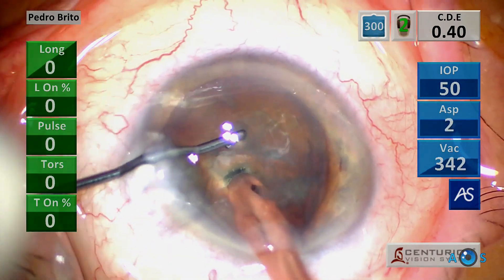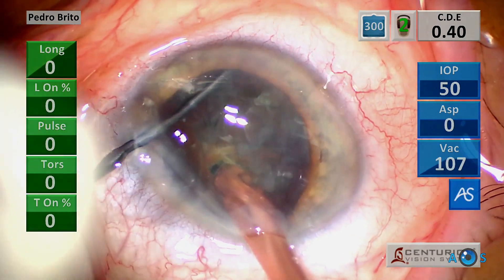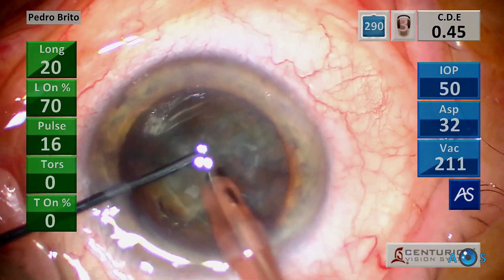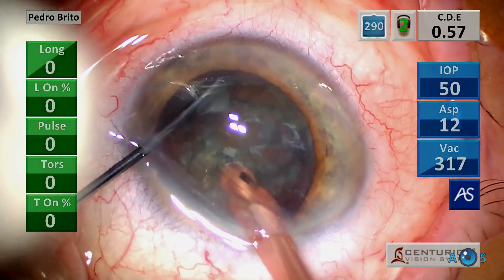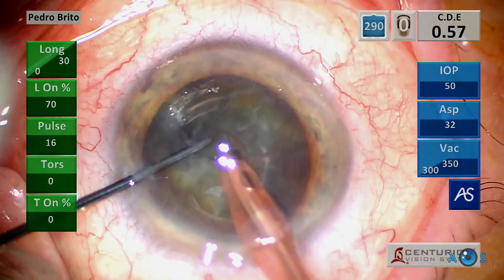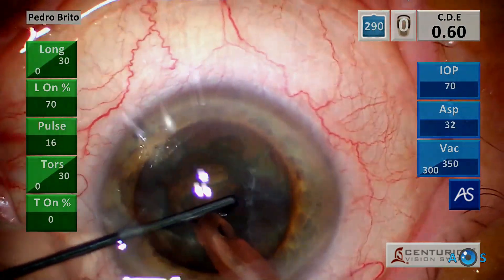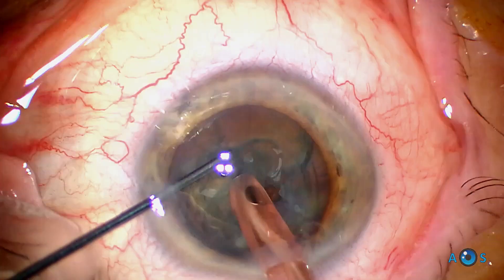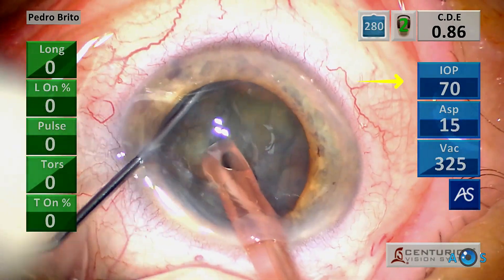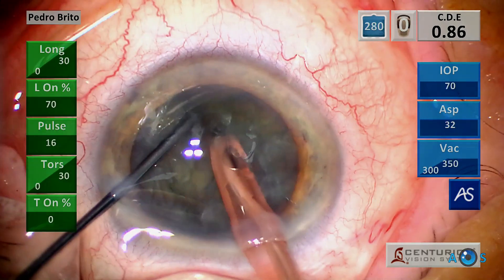We begin with the first central chop. Notice that the IOP is set to 50 mmHg, which makes the procedure more comfortable for the patient, but the anterior chamber is feeling somewhat soft, so the chop was a bit superficial. Just rotate the nucleus and repeat the maneuver. For this step I prefer the chamber to feel more solid and stable, so the IOP was raised to 70 mmHg, which facilitates precise chopping.